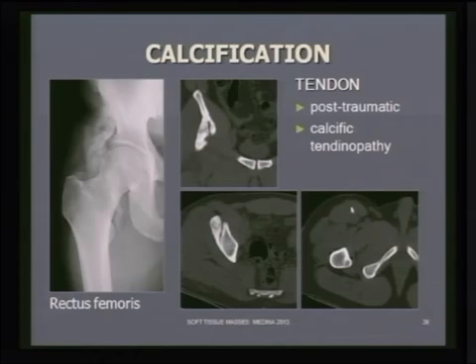Within tendons, we have seen cases of poorly defined, fairly minimal calcification within tendons, sometimes associated with bone erosion. And these can, again, have fairly alarming features on MR, but we have to remember that calcific tendinopathy is a condition which can produce those features. We've seen it most commonly presenting to the sarcoma service in the insertion of gluteus maximus into the posterior thigh. And it's important just to remember the possibility of that diagnosis and to confirm the diagnosis with CT.